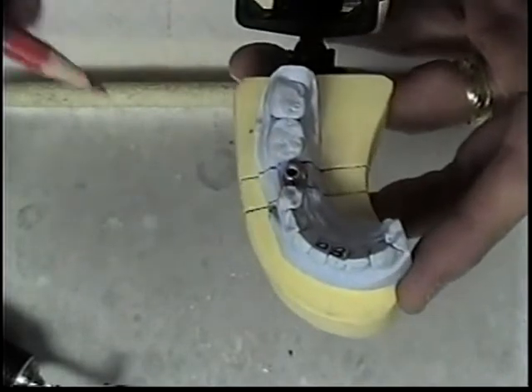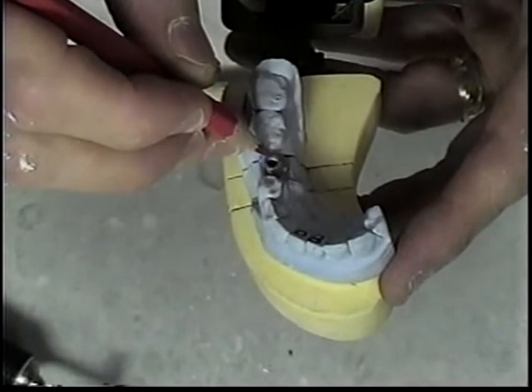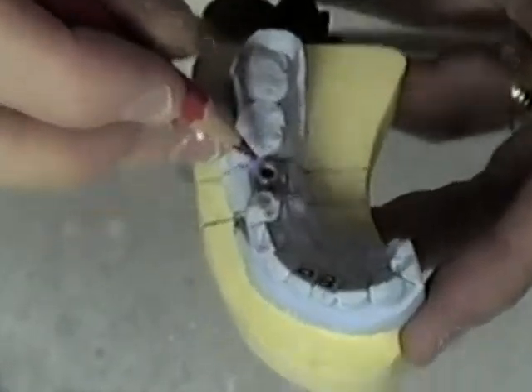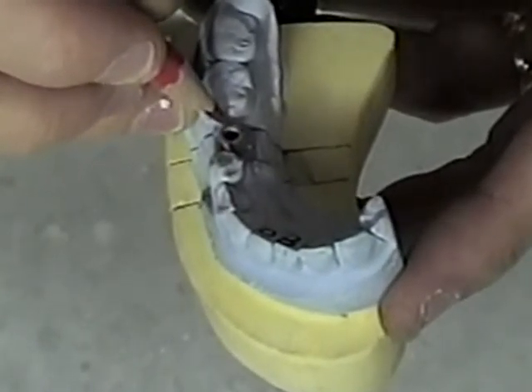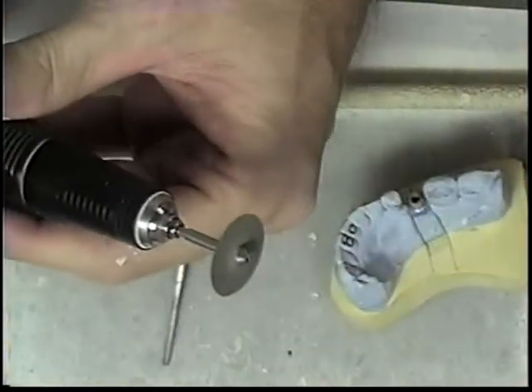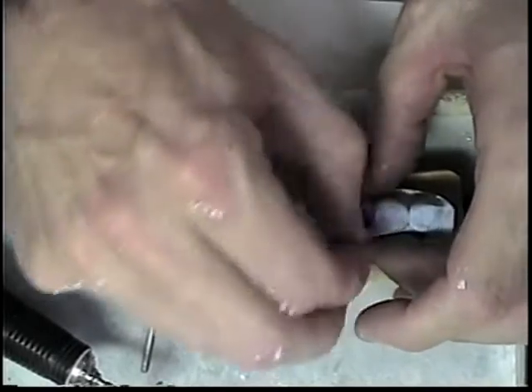We want some retention in this abutment, some stabilization for the crown, so I'm going to create a lingual and a buccal cusp here. I'm going to create a V into the top of this abutment. What I do is I just mark a line down the central fossa with the teeth there, then I'll get my separating disc and create a V into that line, creating a buccal and a lingual cusp.